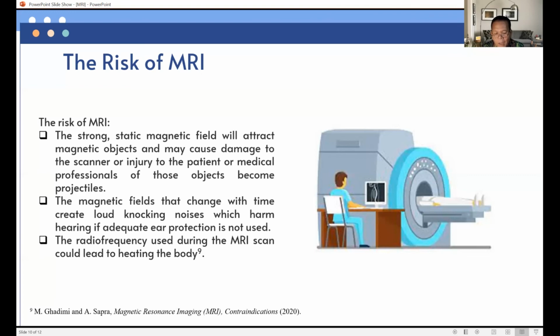In general, T1W and T2W images can be easily differentiated by looking at the CSF, or cerebrospinal fluid. Cerebrospinal fluid is dark on T1W imaging and bright on T2W imaging.